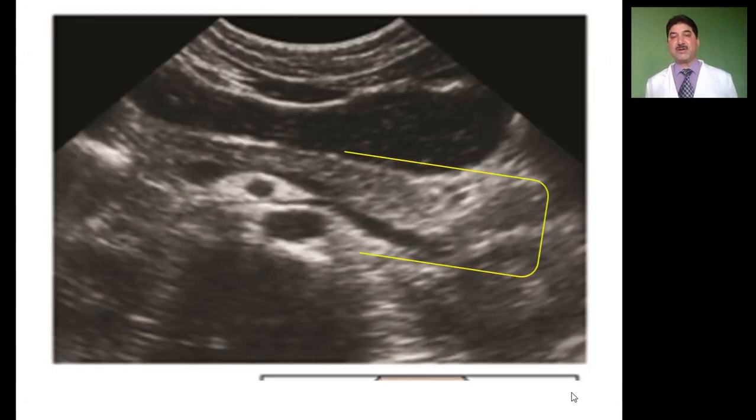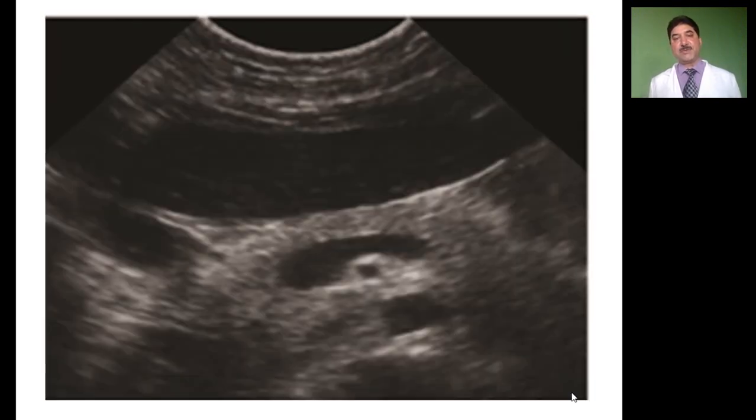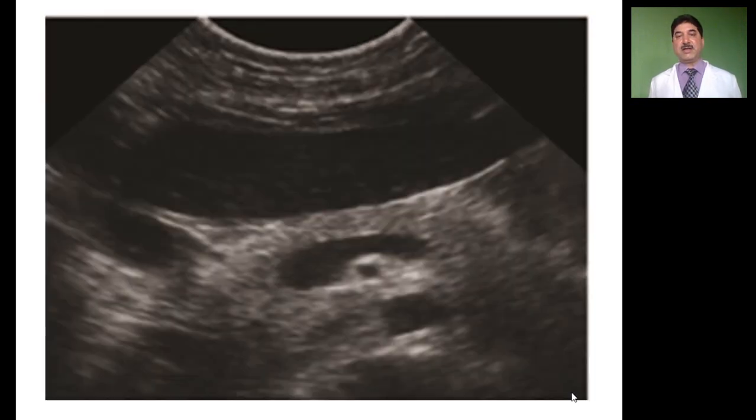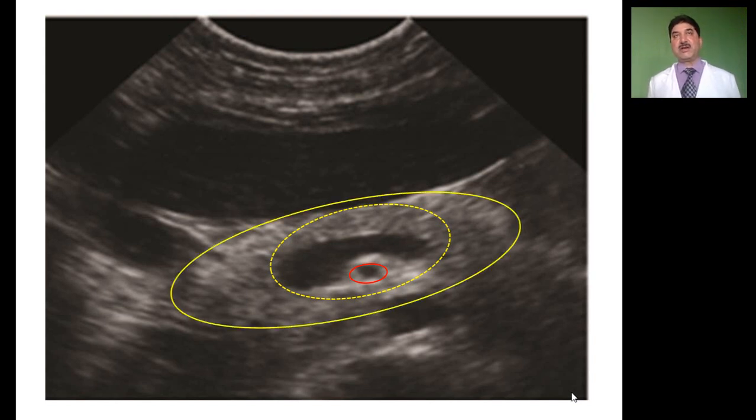Now, if we go to the ultrasound, we see this hyperechogenic shadow represents pancreatic tissue. In this shadow, we have the portal vein, the splenic vein draining into the portal vein, and the superior mesenteric artery. Again, in this figure, the superior mesenteric artery, the pancreatic tissue, and this comma-shaped vein represent the drainage of the splenic vein into the superior mesenteric vein. And this hyperechogenic tissue which wraps over the splenic vein is the pancreas.